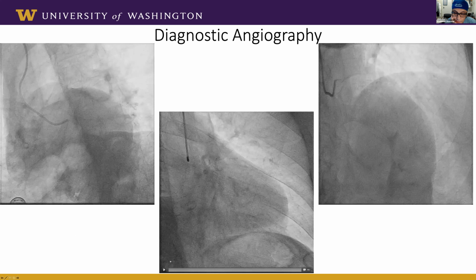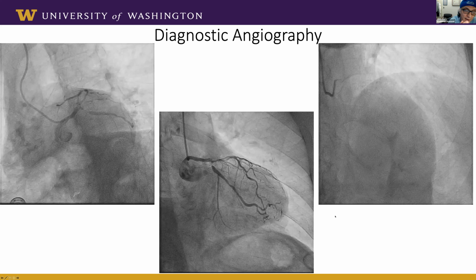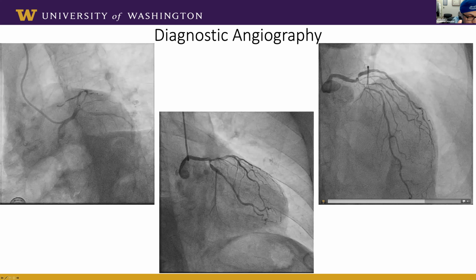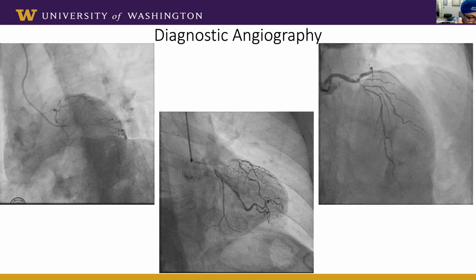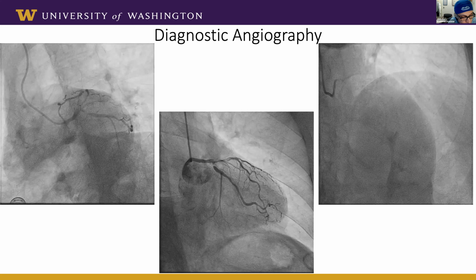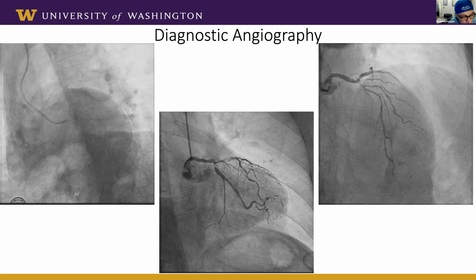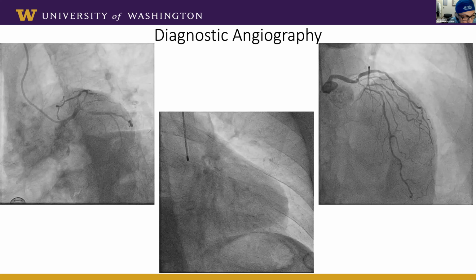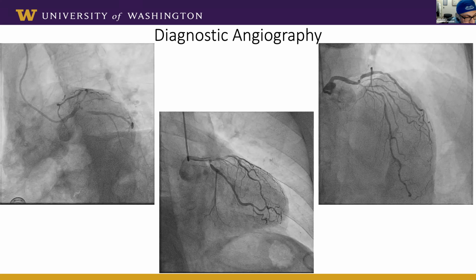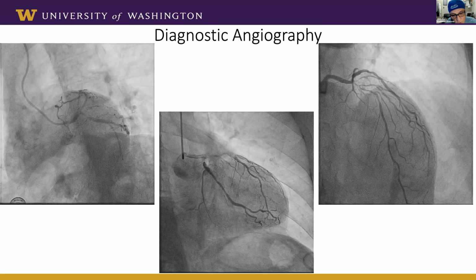So Kate and Catherine, this is a quadrification. How many branches do you have? Can you go back to the column? Yeah. So I think there is a very high diagonal. There is an LAD, I can't really tell from here. Oh, that's septal, just a high septal. Okay. So you have basically LAD, diagonal, slash, I mean, ramus probably, that has an ostial disease. And you have a significantly tight lesion in a proximal circ.